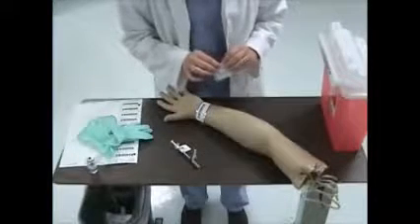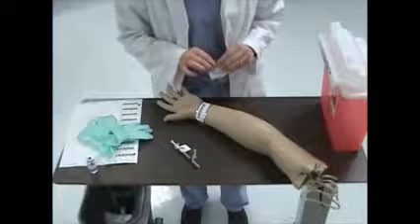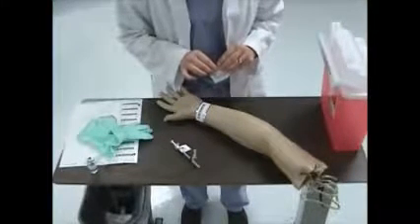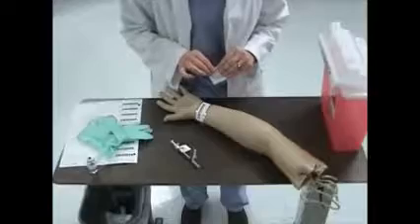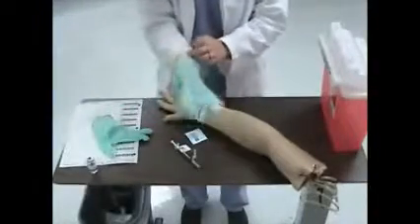Another important thing to do is to ask your patient if they've ever received a PPD injection and if they've ever had any type of reaction to it. If they respond by telling you they've had a reaction to a PPD, they should not receive this injection. At this point, I'm going to put on my gloves for administration.